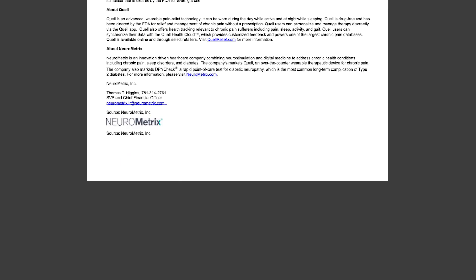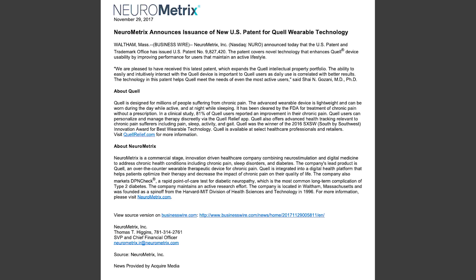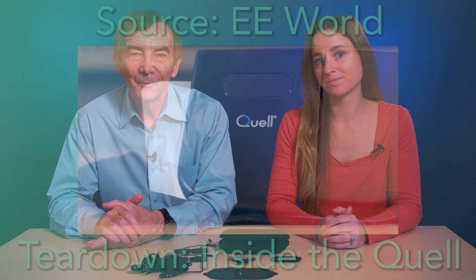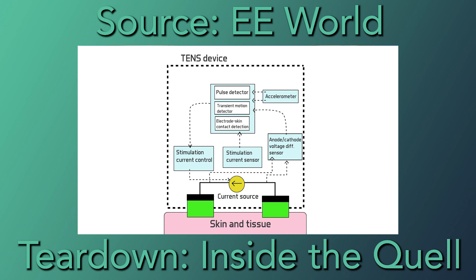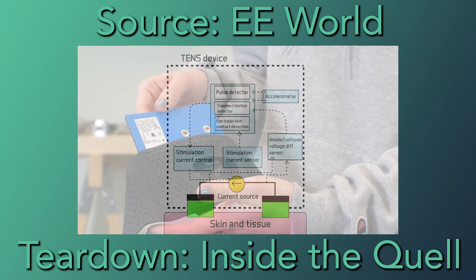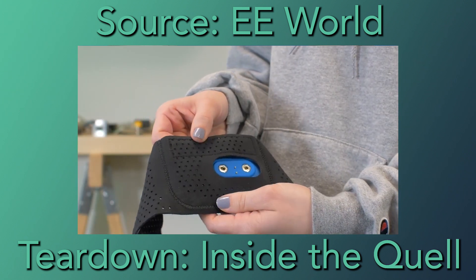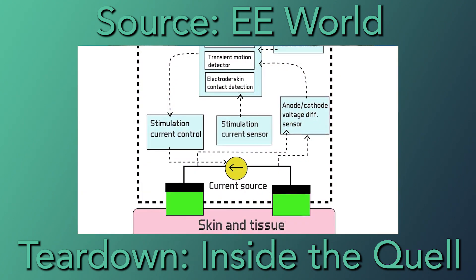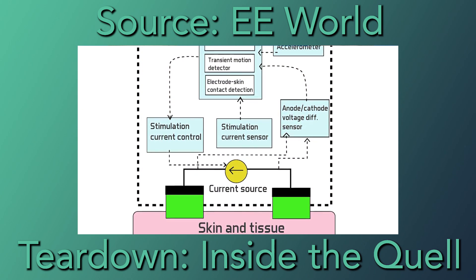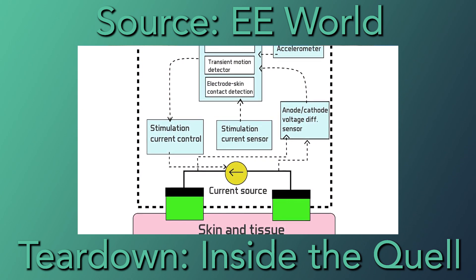We can glean some of the functions of Dr. Pocket's drive electronics from patents filed by Neurometrics, a noted developer of the earlier TENS device called the Quell. It's likely Dr. Pocket's basic operation resembles that of the Quell. As the Neurometrics patent explains, the Quell uses a current source rather than a voltage source to drive the electrodes, because stimulation current is independent of the impedance between the electrode and the skin, which changes while the device is in use. The voltage, of course, will change if the impedance changes. Thus, it's likely Dr. Pocket also synthesizes a current source to drive the electrode pad.